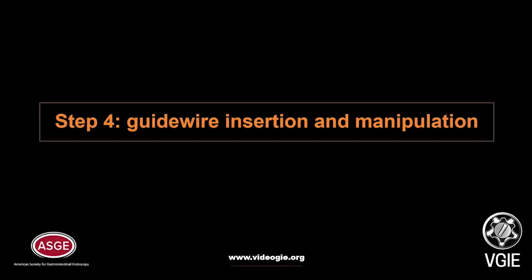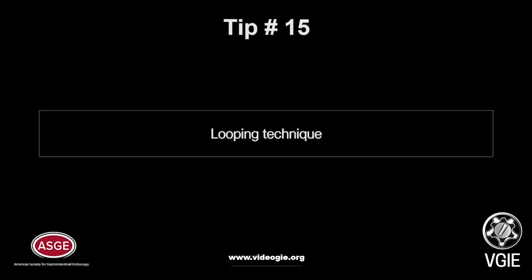Step 4. Guide wire insertion and manipulation. When the guide wire is passed towards the periphery, the following tips or techniques are helpful to redirect it towards the hilum. The looping technique.